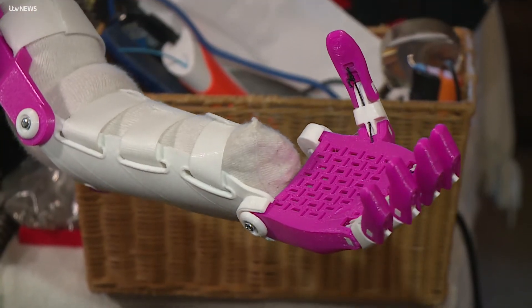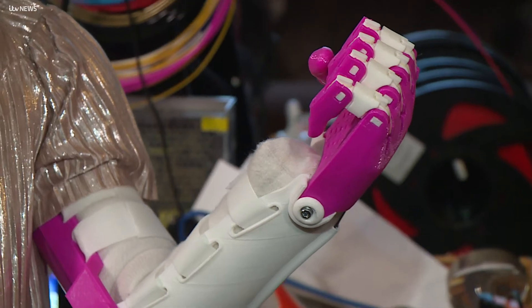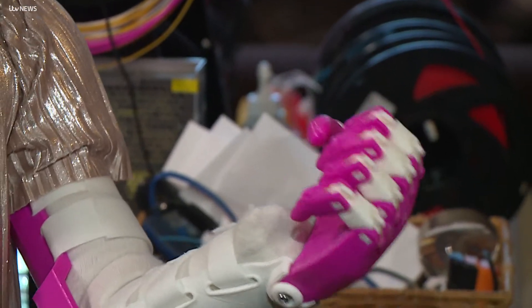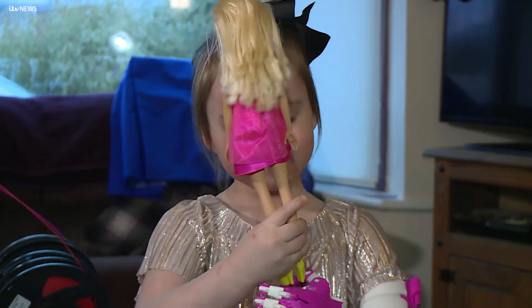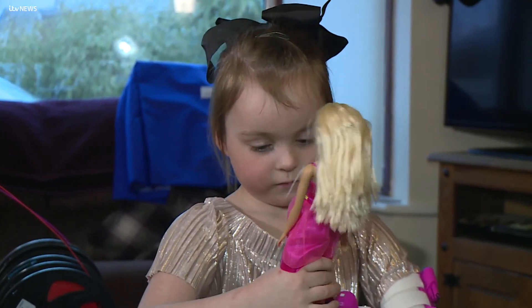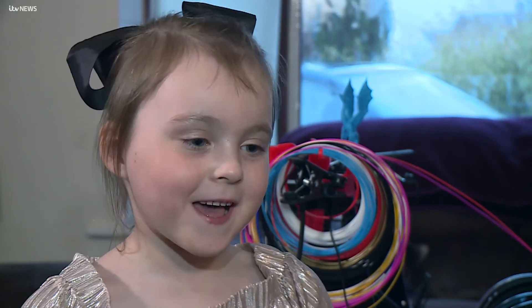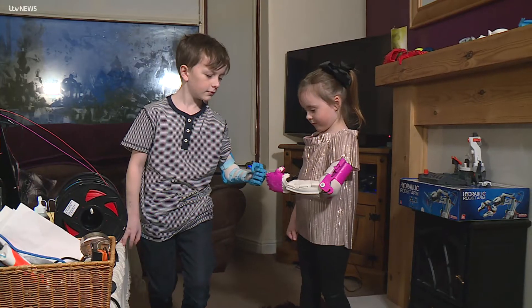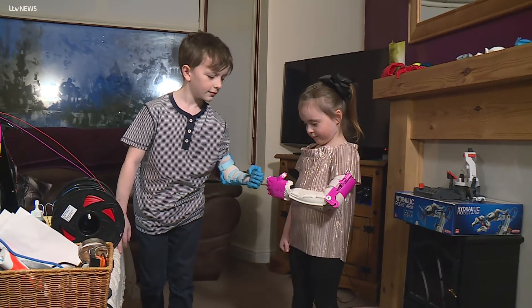It takes around 15 hours to make an arm — time well spent to help Keira play with her toys. I'm going to use it to hold things. My dollies and stuff. My feet go there and the head goes where the fingers go, to hold it. With a bit of help from Jamie, Keira is quickly getting to grips with her new arm.